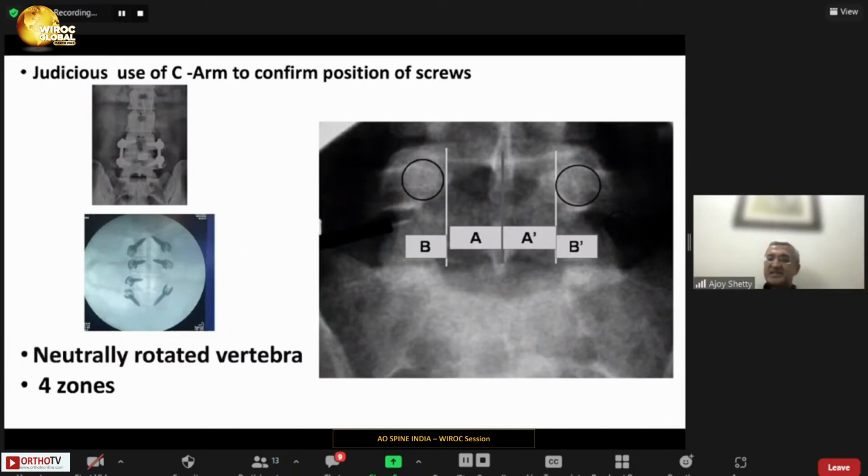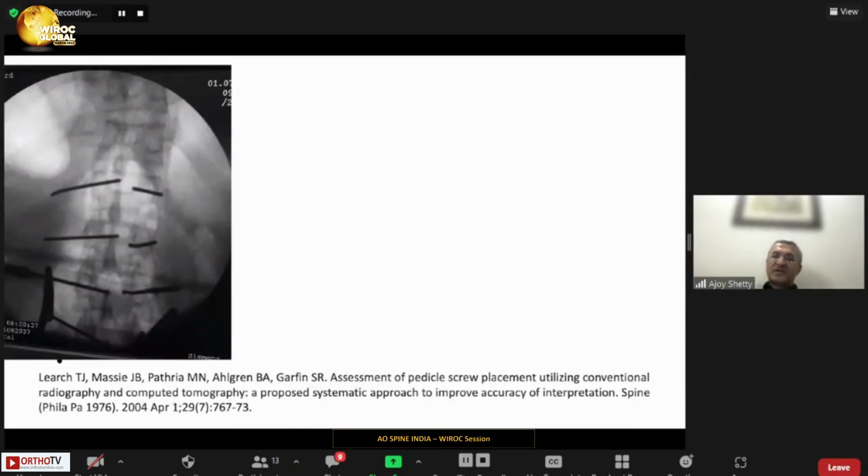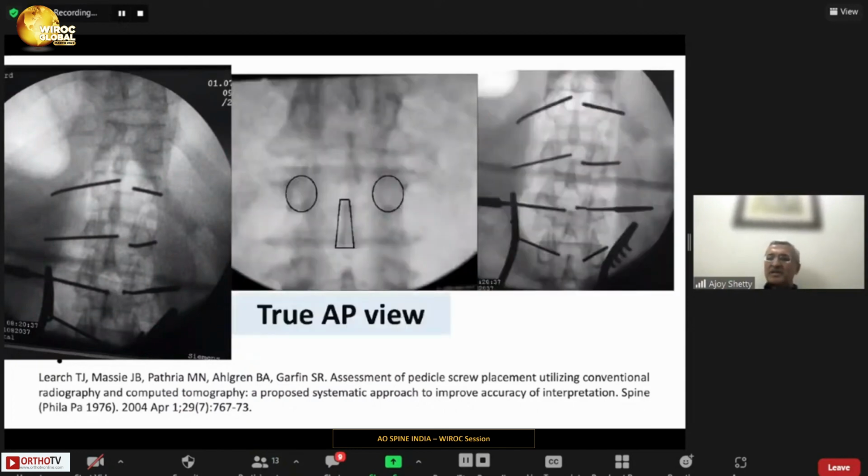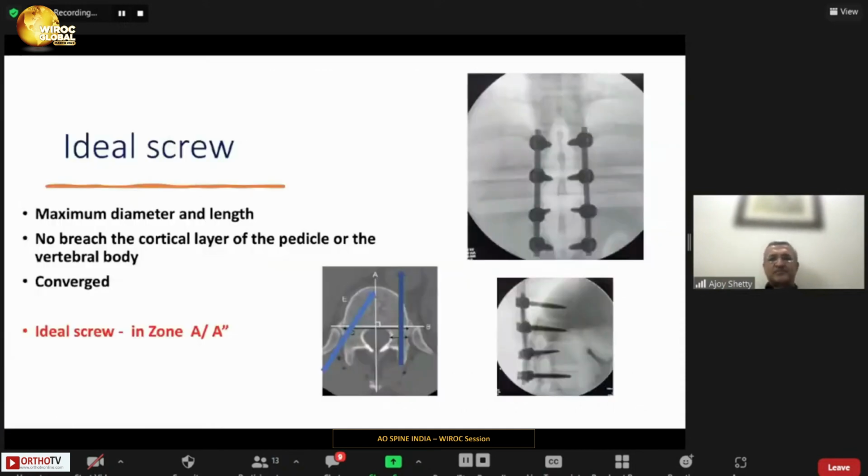And this is very, very important, as you can see in this particular picture, when the probes have been placed and it looks like they are crossing the midline. But when you derotate and make the picture centered with an appropriate AP view, with the spinous process centered between the two pedicles, you can appreciate that the tips are not crossing the midline. This is very important when you are intraoperatively evaluating your instrumentation, and your guide wires are following your fixation.